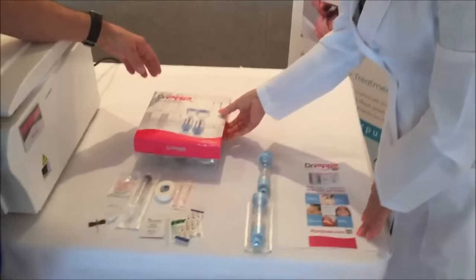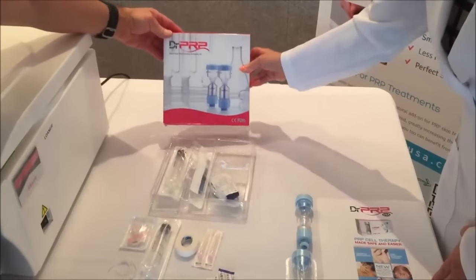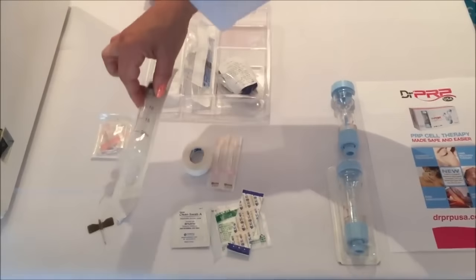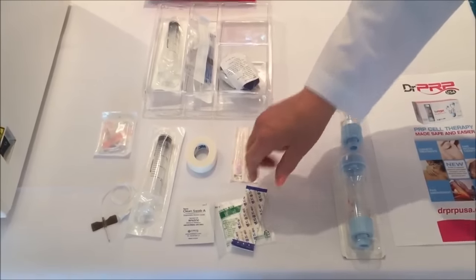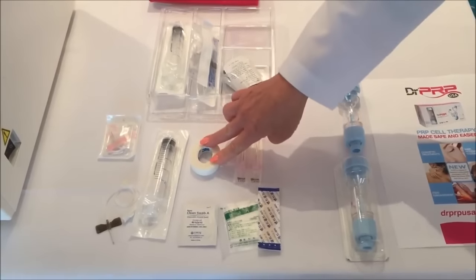First, you're going to need to use an accessory kit to draw blood. In the accessory kit, you will have all the components that are necessary to do the phlebotomy and to process the blood. There is an 18-gauge phlebotomy butterfly, a 20cc syringe, blunt needles for the blood transfer, a bandage, alcohol swab, gauze, and some tape.